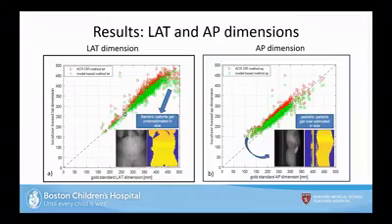You want to be able to estimate the dose to the bariatric patient as accurately as possible. And a lot of these points here fall a lot lower than what you would expect. So you don't want to underdose the patient. It's not like some of these points here which are not significantly different. This point here is pretty different than what we would expect it to be. What is the ACR requirement? Oh, what's the cutoff? Yeah, 20%. A lot of these points are fine. I would argue that these ones are kind of cutting it close. So you have to be within 20%. That's the threshold, or the cutoff.